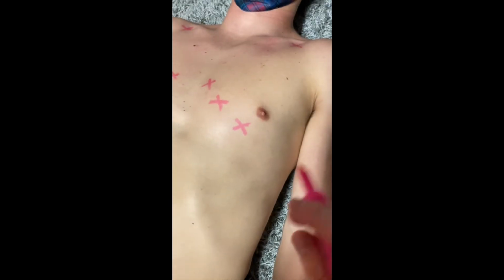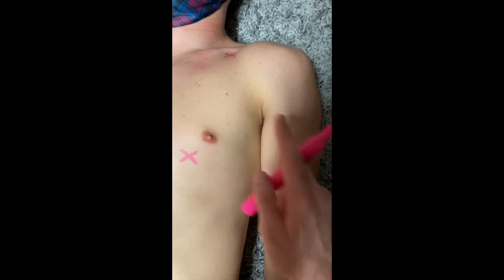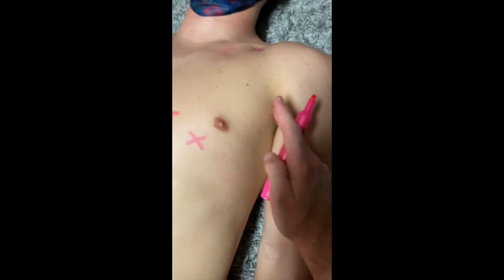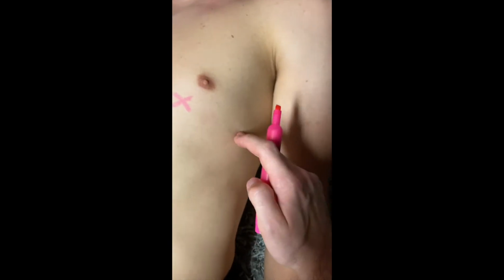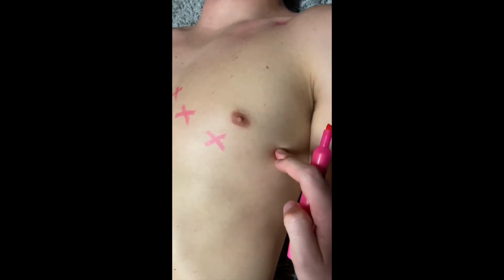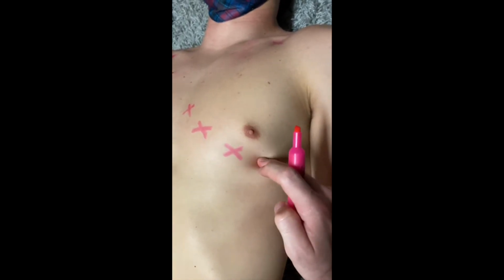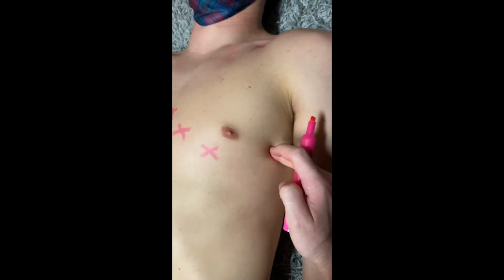So V5 is in the exact same horizontal plane as V4. So you can see right across in the anterior axillary line right on it. So you can see this armpit crease right here. We're gonna follow that down. And then Josh doesn't have super good ribs right here, but that's okay because we can feel down from here. I mean, then we can follow this because it has to be in a rib crease.